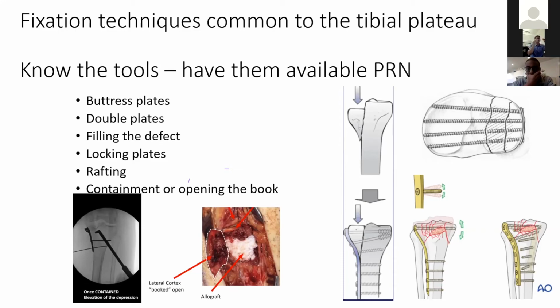And in bicondylar plateaus, do you even need it because you're putting dual plates to buttress everything up? So likewise, your diving board has support on either side. So stay tuned on that one.